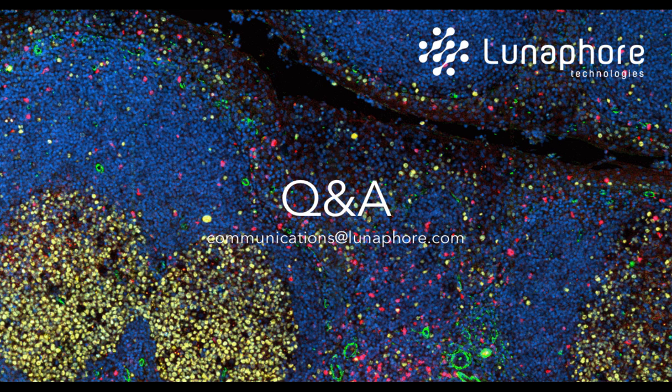Some attendees are asking about some more details about the microscope. So what can you tell us about the microscope coupled with COMET? So for instance, magnifications, can we choose one area or more, etc.? All right, so the COMET has one objective. In terms of objective magnification, it's a 20x. However, because we use a rather high numerical aperture objective, we can zoom in and look at the tissue as if it was a 40x magnification in classical pathology images, let's say, and then we can take the regions of interest as we like. I hope I answer the question.